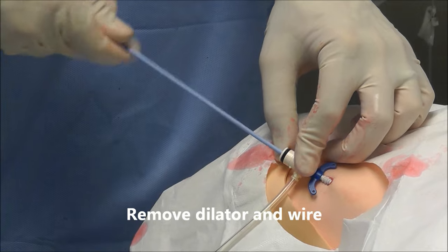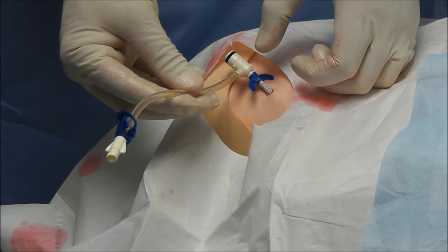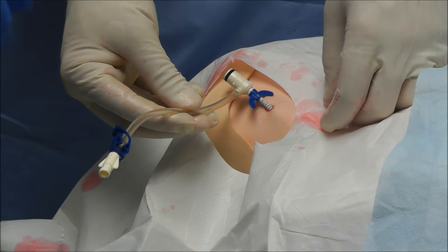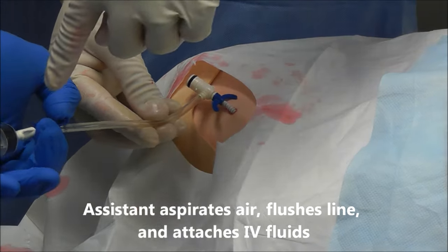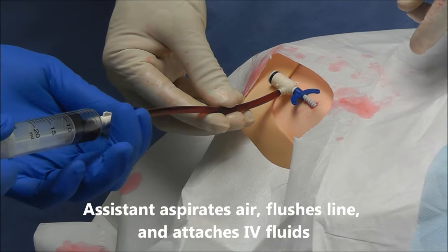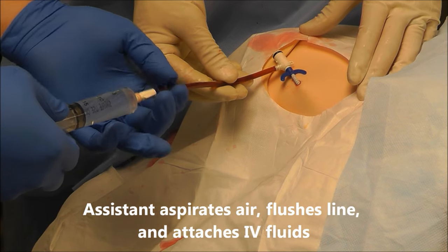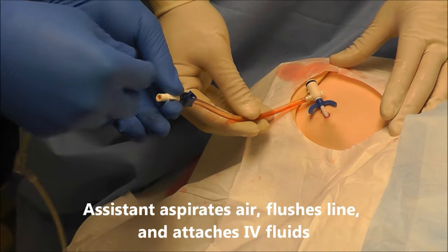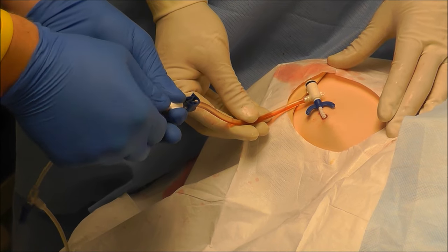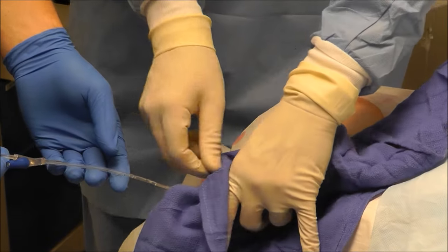Now that line is in, I can remove the dilator and the Seldinger wire. Once that's in, I'm going to need my assistant to flush this line for me and hook up fluids. That part is no longer sterile, so I can't touch that anymore. Now that it's not sterile, I'm just going to cover it with this blue drape.